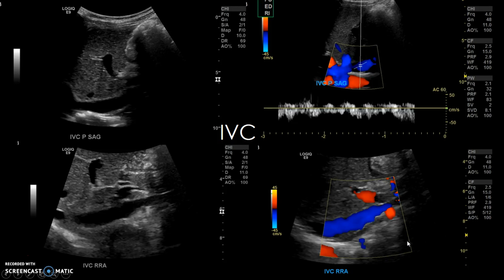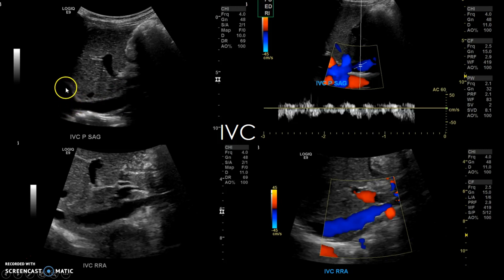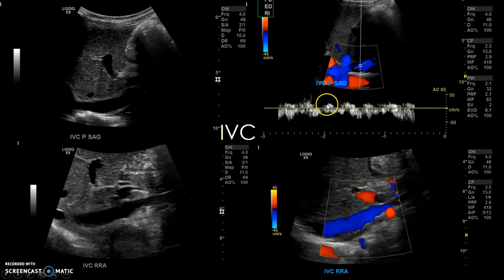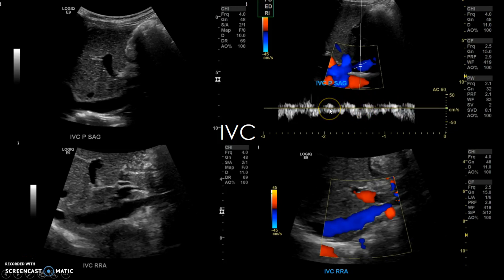After the aorta, go to the proximal IVC. You can see it going into the right atrium, and you can also see the right renal artery behind the IVC. There will be phasicity in the IVC waveform as the patient breathes.